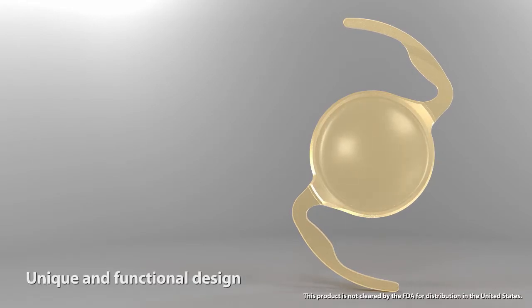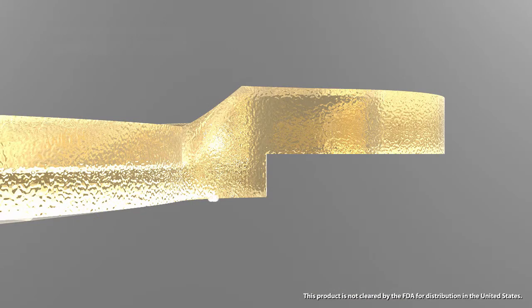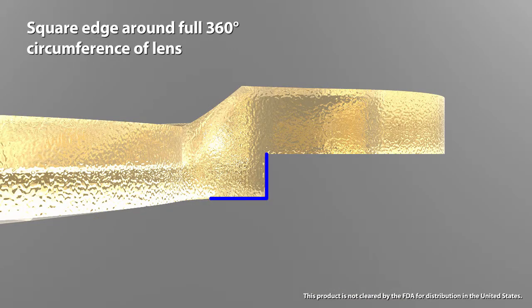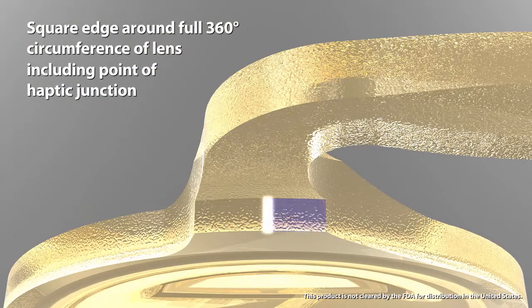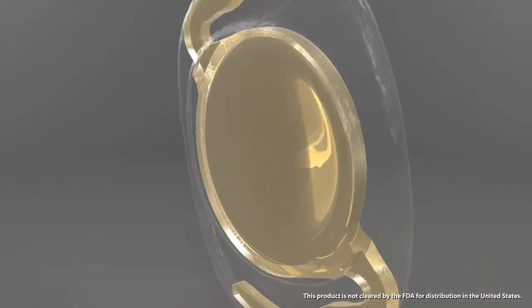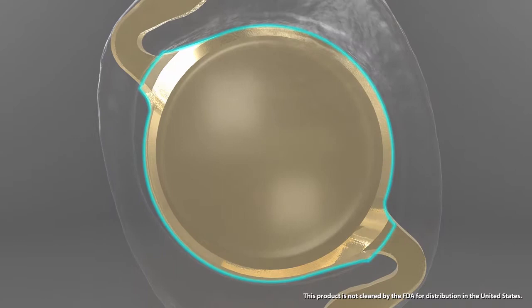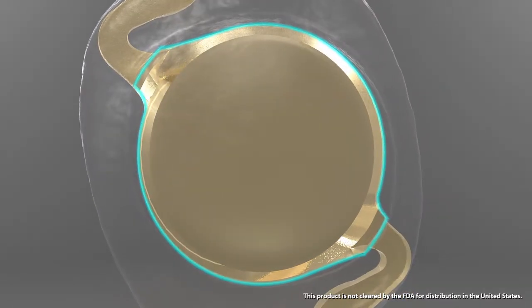The Actis SP has a unique and functional design. It features a square edge around the full 360-degree circumference of the lens, including the point of haptic junction with a small gap. This enhances bonding of the IOL surface to the posterior capsule, minimizing the risk of posterior capsule opacification.